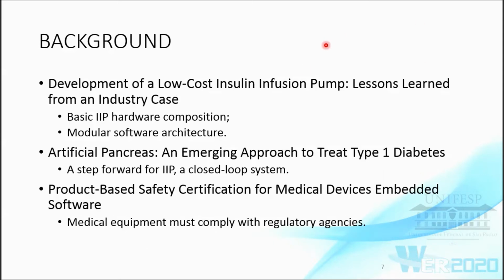And when it comes to the development of the equipment, there is this paper that proposes a prototype of a low-cost insulin infusion pump. On it, the authors propose the basic insulin infusion pump hardware composition and also propose the software architecture that is a modular one. And moving forward on the technology, there is the artificial pancreases. Those are closed loop systems where the blood glucose reading is performed in real time with automated action. And there's also the importance of certification of the equipment from the intended market.